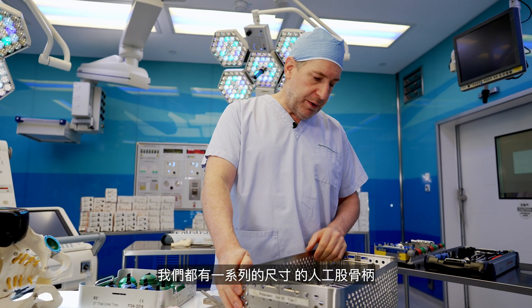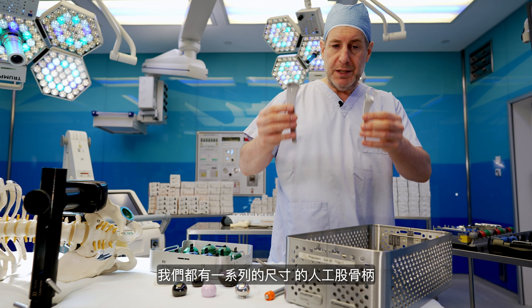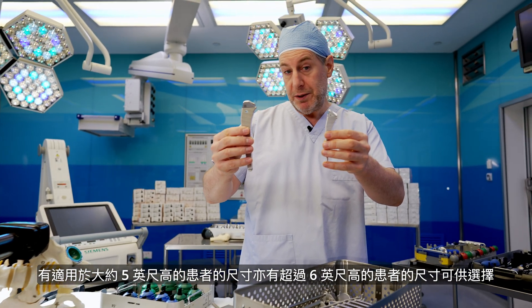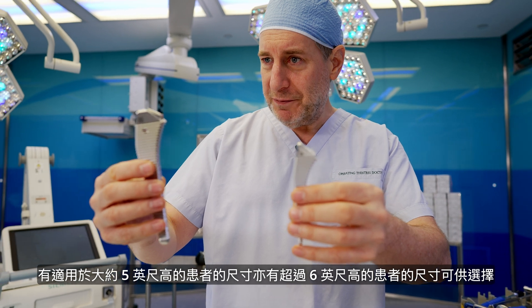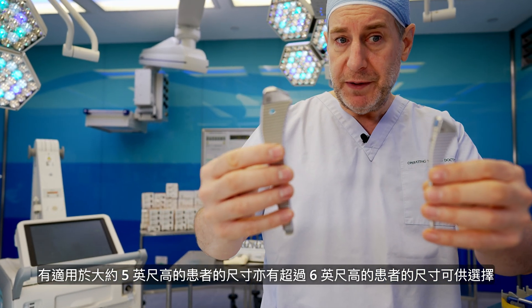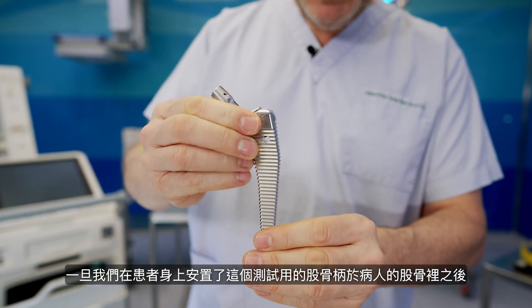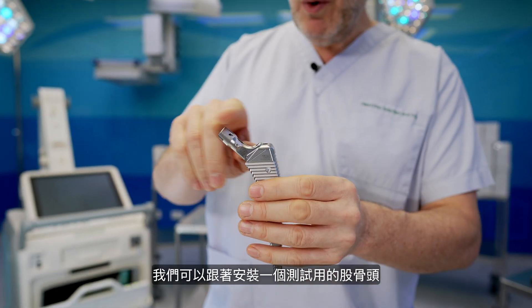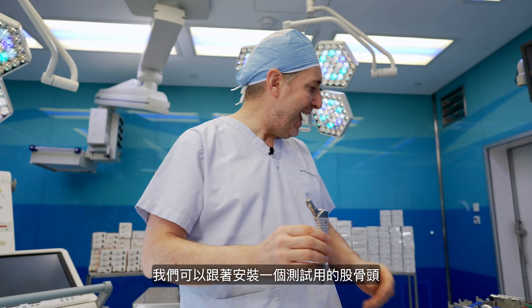The femur, or thigh bone — we have a large range of sizes. There's the smallest for a patient about five feet or less, and there's the biggest for a patient who'd be much over six feet. Once we've positioned this femoral trial in the patient's thigh bone, we can attach a trial femoral head.